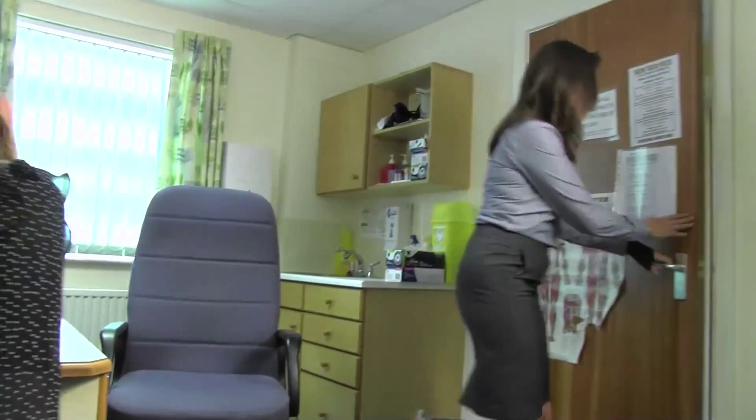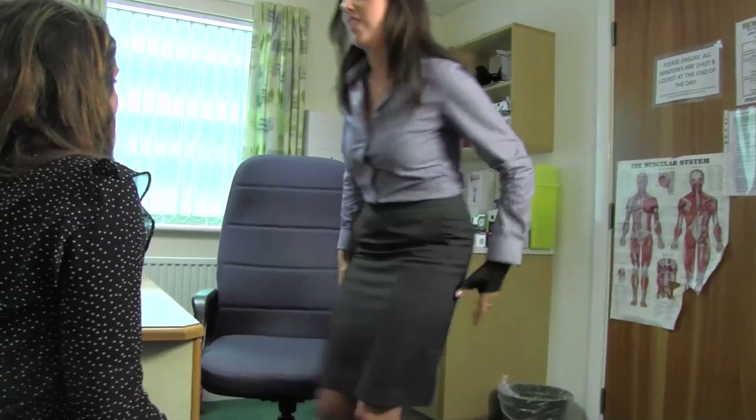I'm a GP working in the local area and I've been wearing the Exos Brace for the last two months. I actually fell over playing netball at the beginning of June and unfortunately broke the scaphoid bone in my left hand. I had a plaster cast for the first month, but then I was told about the Exos Brace and because of the fact that you can get it wet and it can be removed, I thought obviously this would be really helpful.